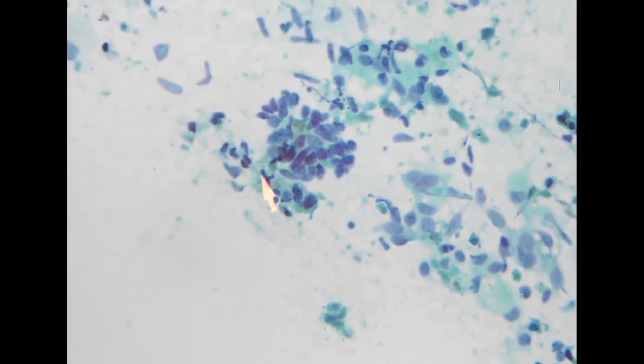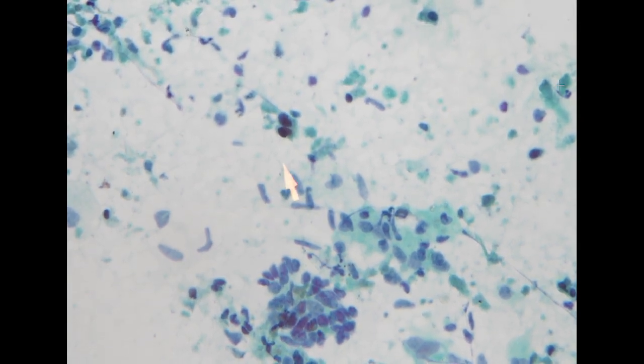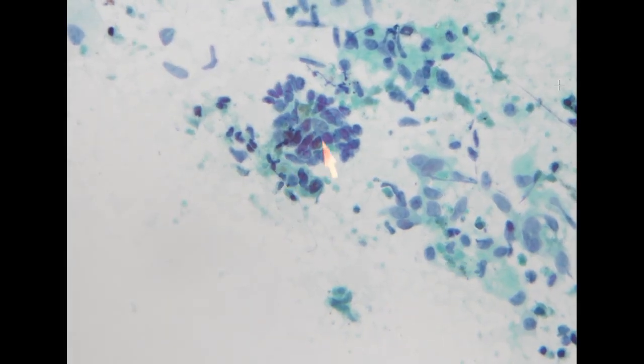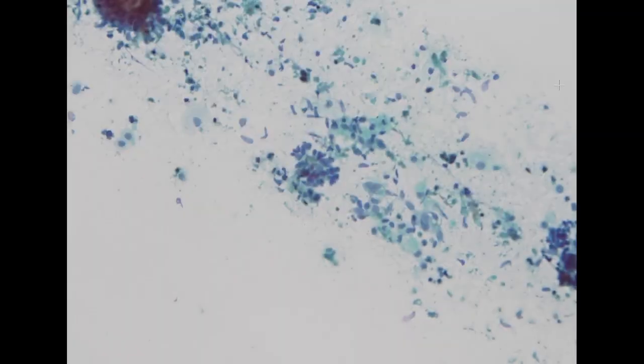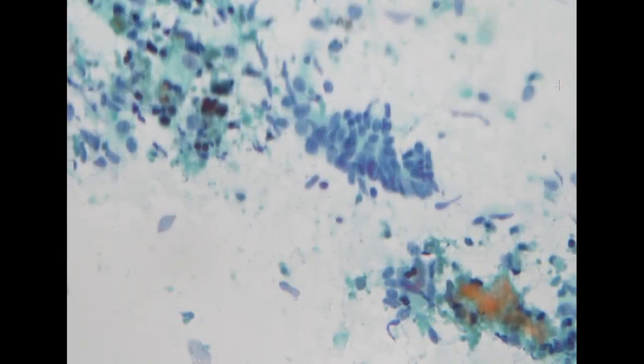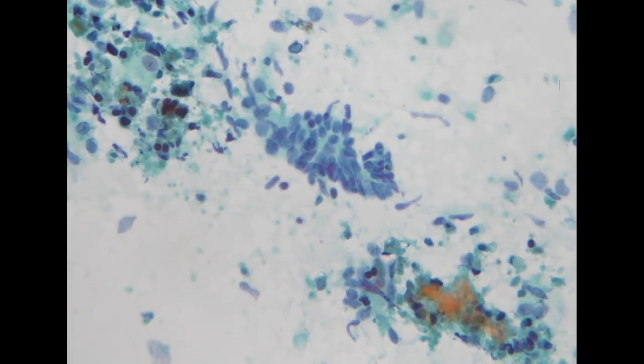It is most commonly what we will see in metastatic colon cancer. So you can see dirty necrosis and stratified, hyperchromatic nuclei in this intestinal type adenocarcinoma morphology. So indeed the patient had a past history of colon cancer and it is compatible with metastatic colon cancer.